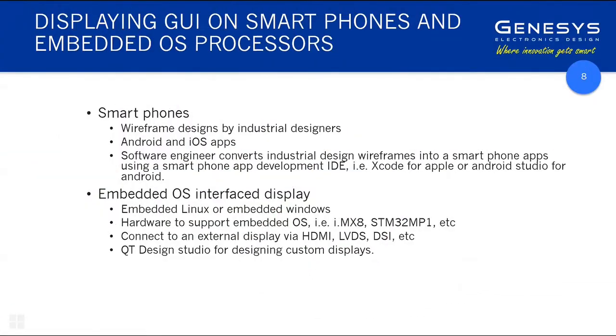Now, displaying GUI on smartphones and embedded OS processors. For smartphones, as James showed you with those flow charts that he had, you then have to take those flow charts and use either Android Studio or Xcode for Apple devices, to develop those different screens and deploy the app.